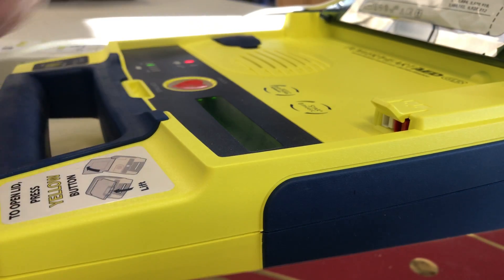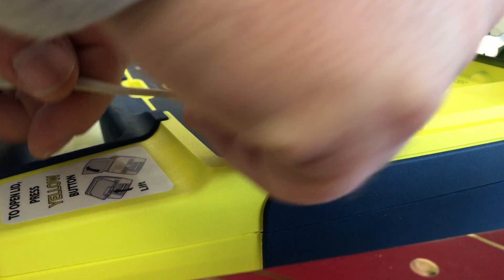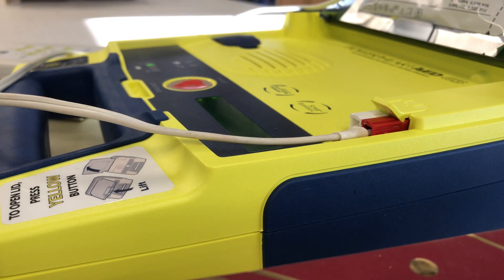Make sure the pad connector is plugged into the AED.